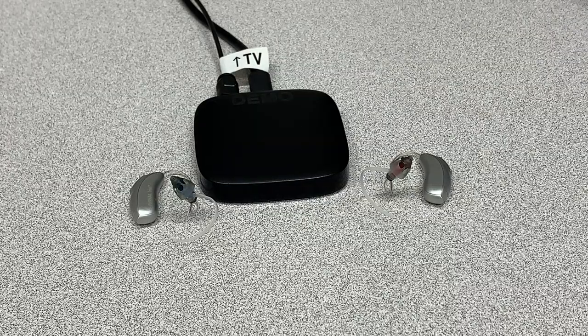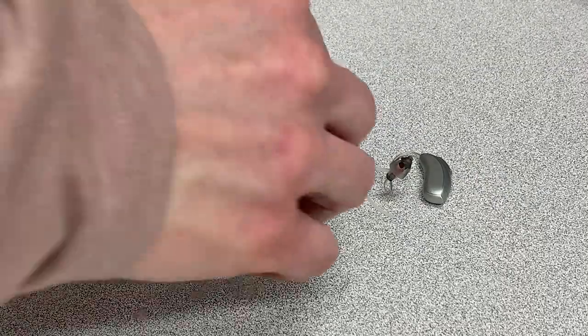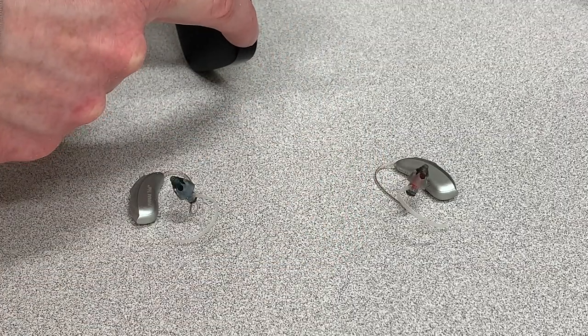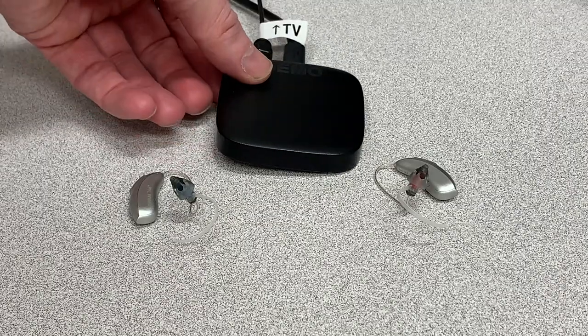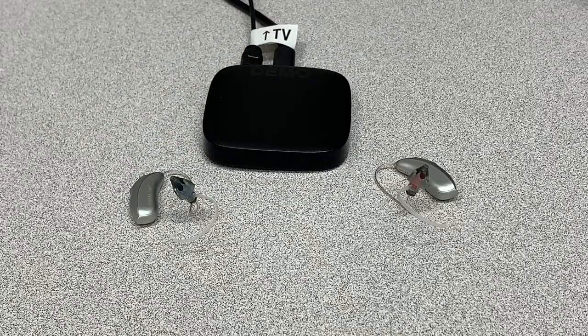We want to make sure that the devices are within one meter of the TV connector. Once the hearing aids have powered on, we're simply going to push the connect button. If you had been wearing the hearing aids, as soon as it switched back from blinking blue to green, you would have heard that audible connection tone inside the hearing aids — and it would happen in both the right and the left.